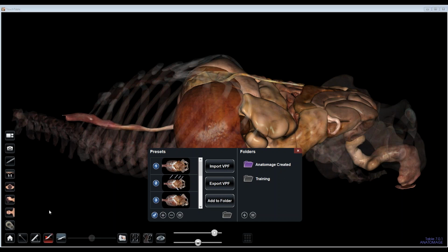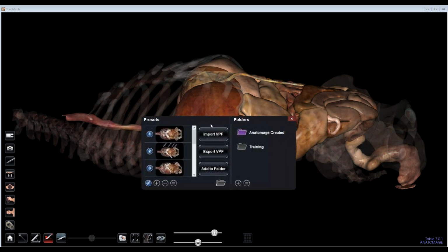So somebody else asked, we could each have separate folders for saved presets. So absolutely, like if you want, you could create a folder for each instructor, and that's certainly an option. But if you created a folder for each instructor, then every preset file would be visible in the list. That may not be quite as organized as you want.